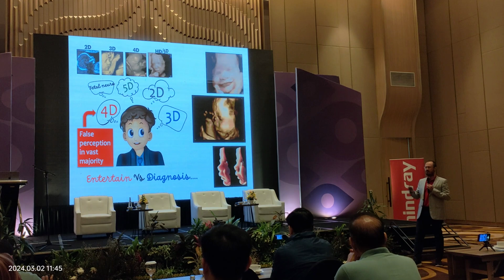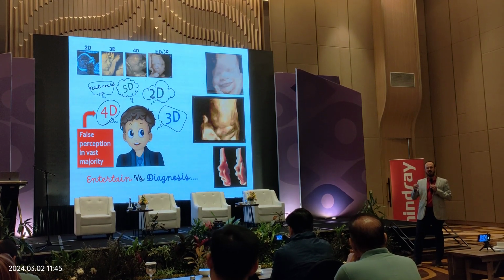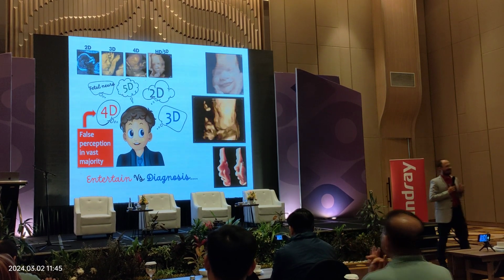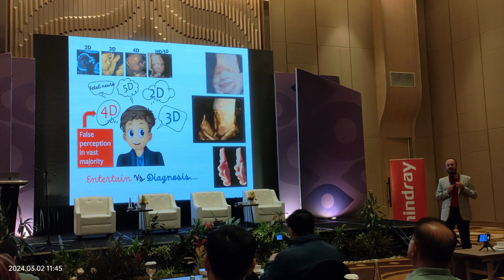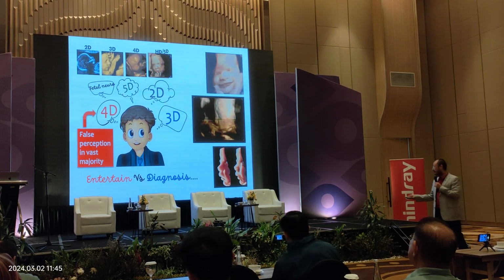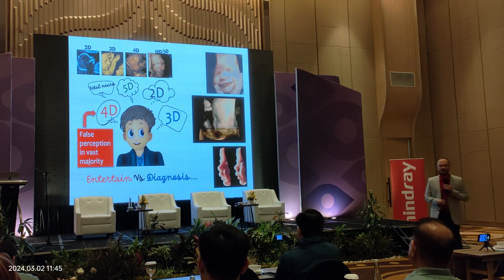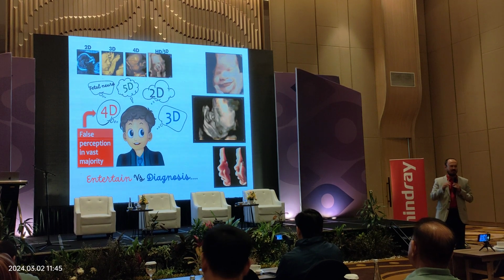"Doctor, I want 4D to determine whether my fetus is alright or not." That is conflictingly unrelated to what we are doing for diagnosis. So entertainment and diagnosis are quite different terms that we have to anticipate.